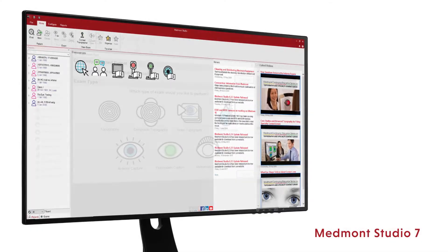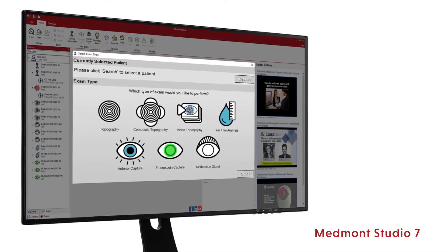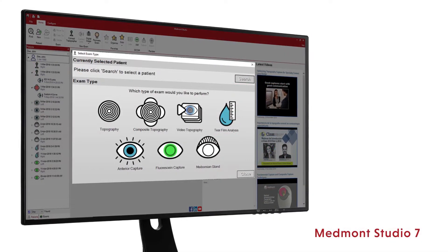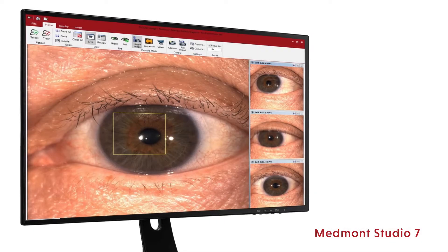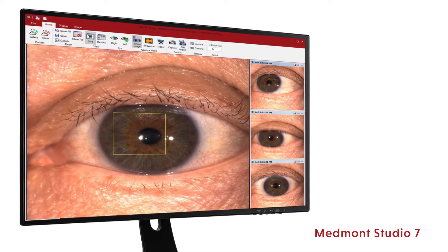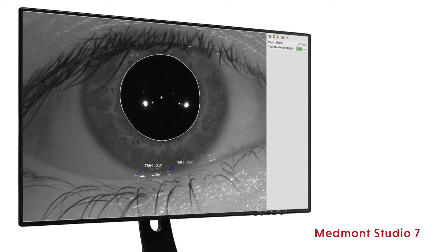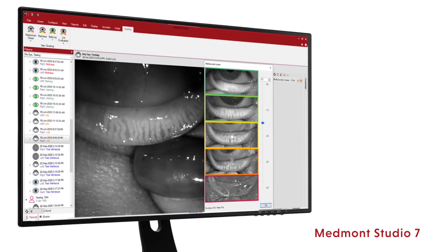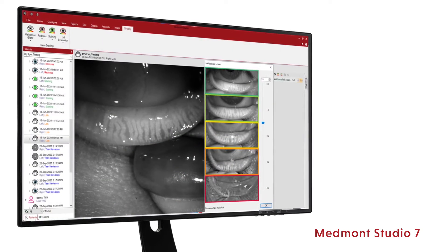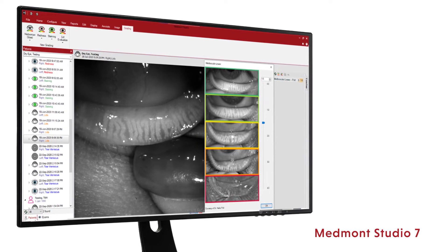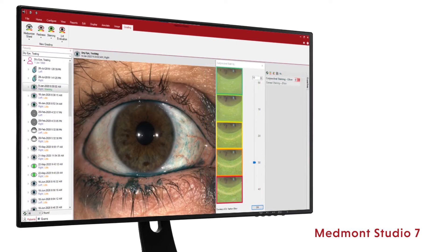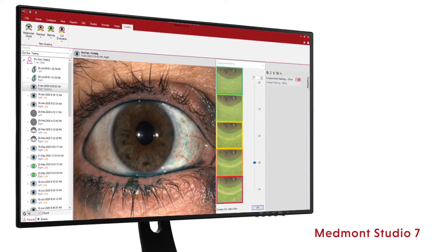The Medmont Meridia offers an entire dry eye assessment suite to assist with diagnosis, treatment, and the ongoing care of your mild, moderate, and severe ocular surface disease patients.